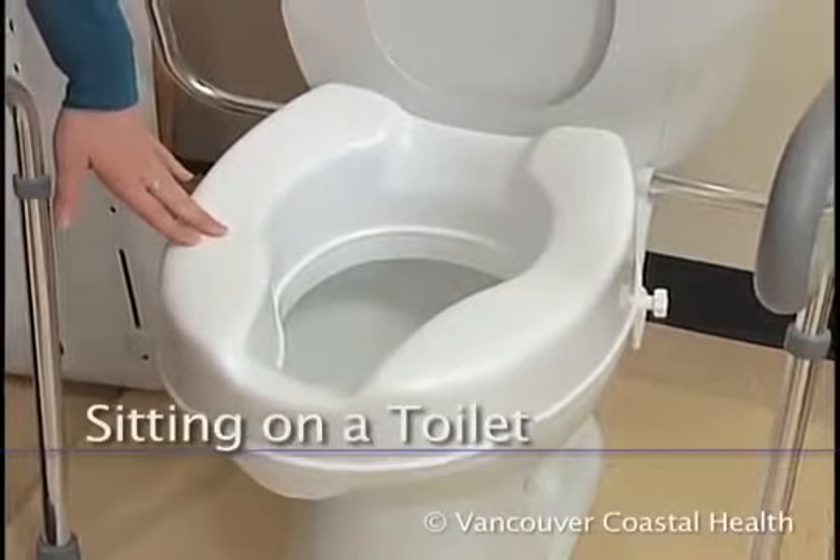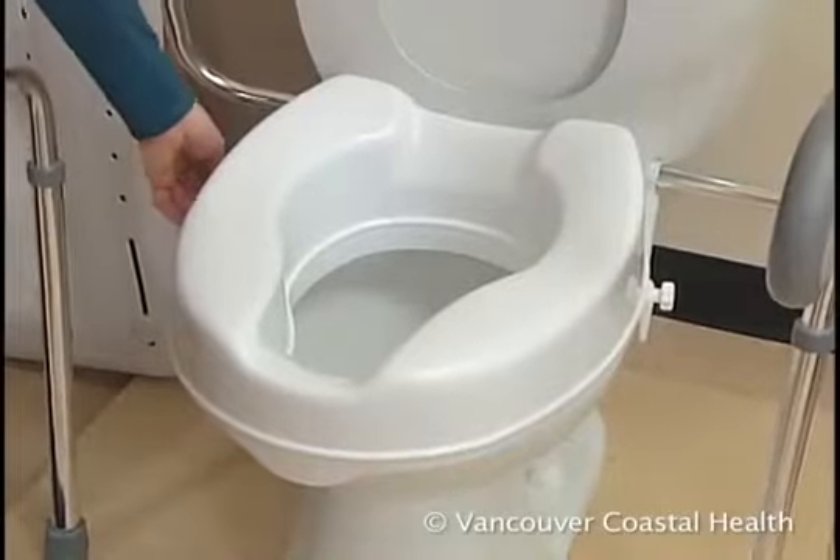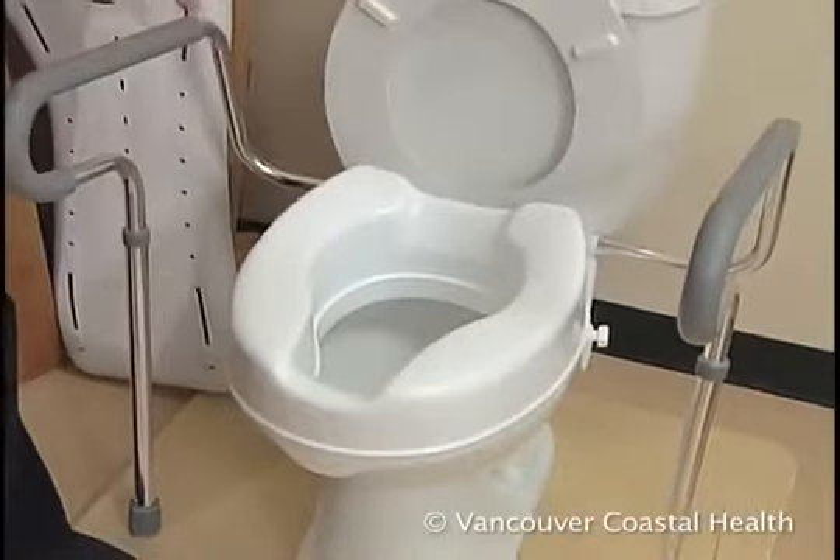As with a chair or bed, the toilet seat needs to be two inches above the top of your knee. A raised toilet seat can bring the surface to the proper height.